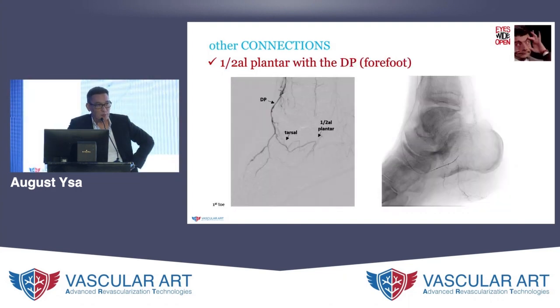There's also a connection between the medial plantar and the DP artery in the forefoot. You may probably think, no, you have already talked about that. This is the deep plantar arch. No, it's not. Look, this is a patient with an occlusion and a wound of the distal DP and a wound in the first toe. We had this patent deep plantar arch.